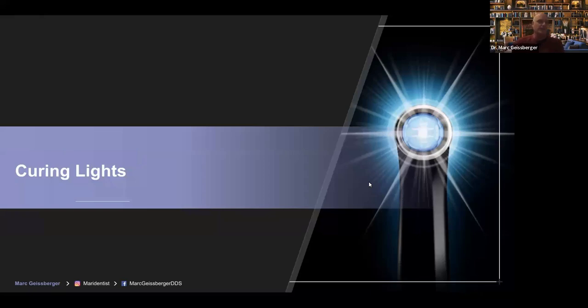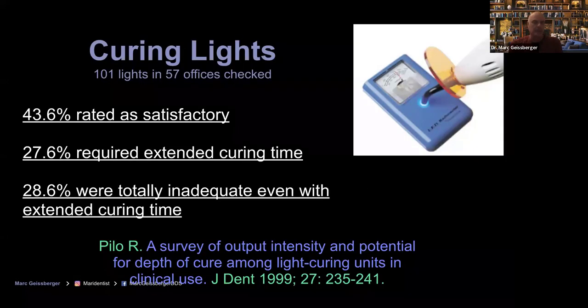Now, the last thing I want to discuss is just a little bit on curing lights. And remember, warmed composites are going to cure more completely. But one little thing to consider in your practice is, are your curing lights working effectively? Now, I use a radiometer, and that's because of this study that's well old now, 1999, that I read back in 1999, that talked about how lights in practice may not be working to the clinician's expectations.